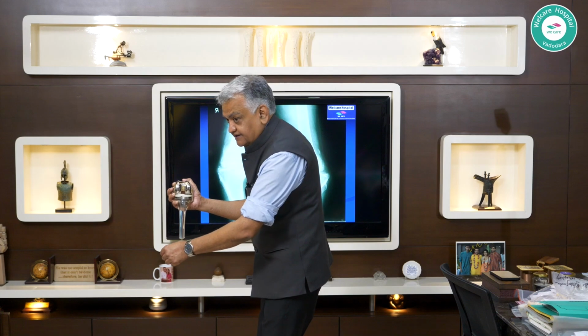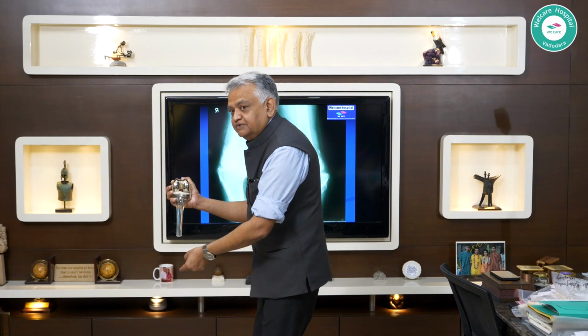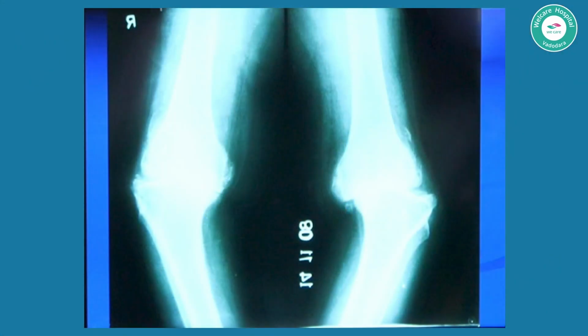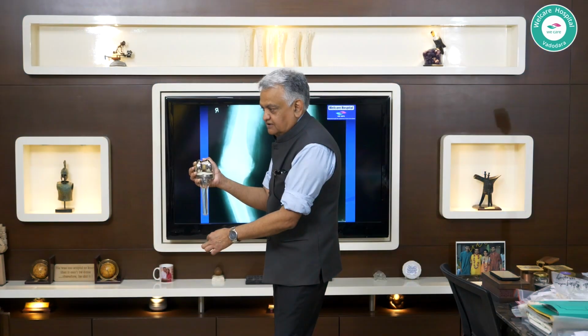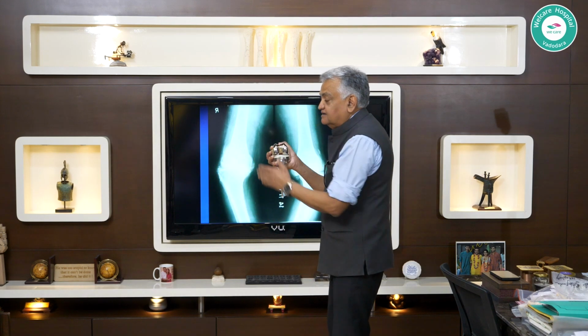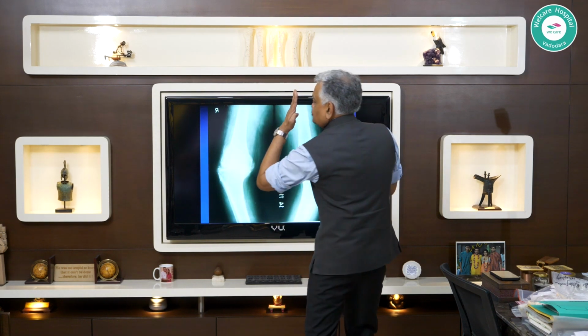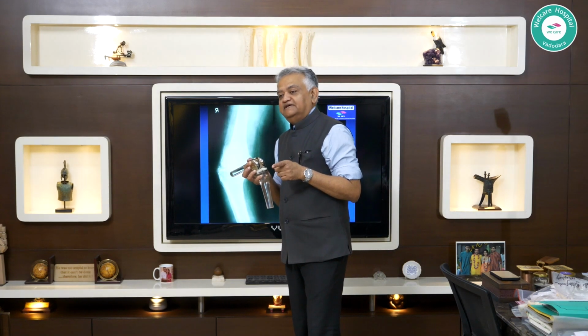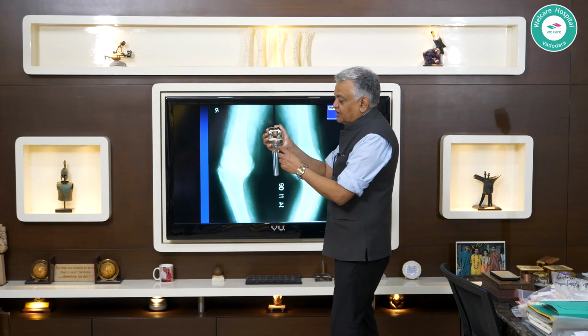Now you slide it here and there, ignore the bend of the tibial shaft. Now you just have to make sure your mind's eye and brain process the midpoint of that tibial block here and the midpoint of that lower jig shaft here, and they have to be in line. If that is looking skewed like this or like that, then you are making a mistake. Are you getting it? If not, later on in the OR, you can ask me with the actual jig there in place in front of you.